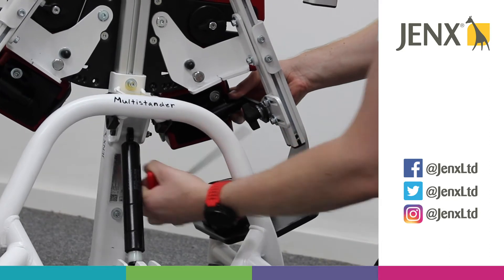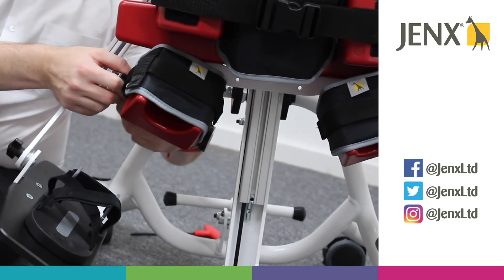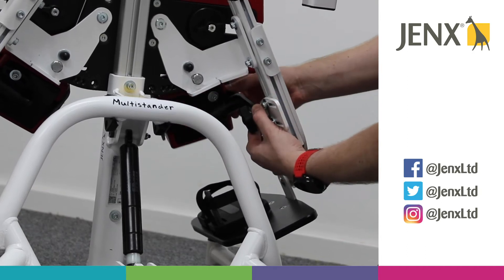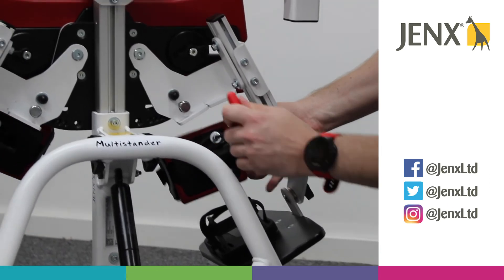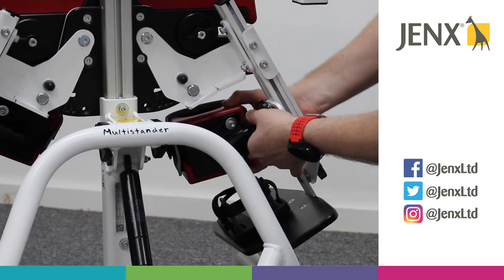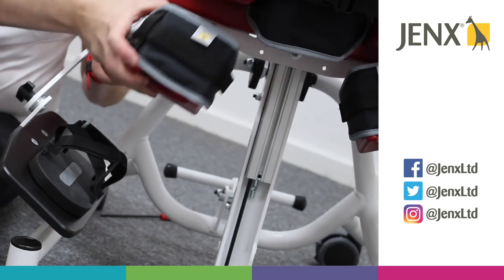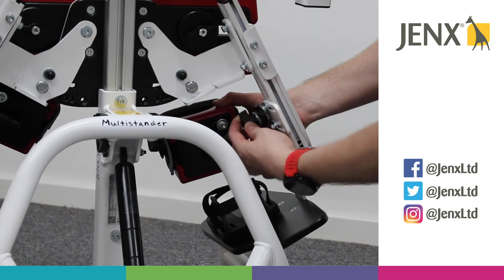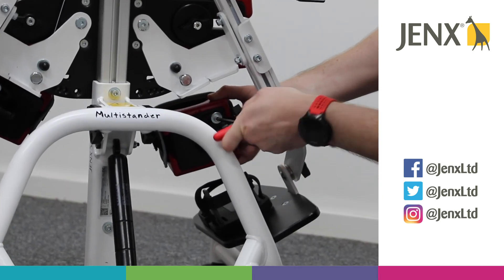We've also got a wing knob on the knee cup itself. If we loosen that off, we can move the knee cup anywhere that we need it to be. We've got another allen key adjustment on the knee cup itself. If we loosen that, we've got movement on the knee cup laterally, but also we can fine tune the adjustment however we need it to be. Once we've found that, we can tighten the wing knob and then tighten the allen key.